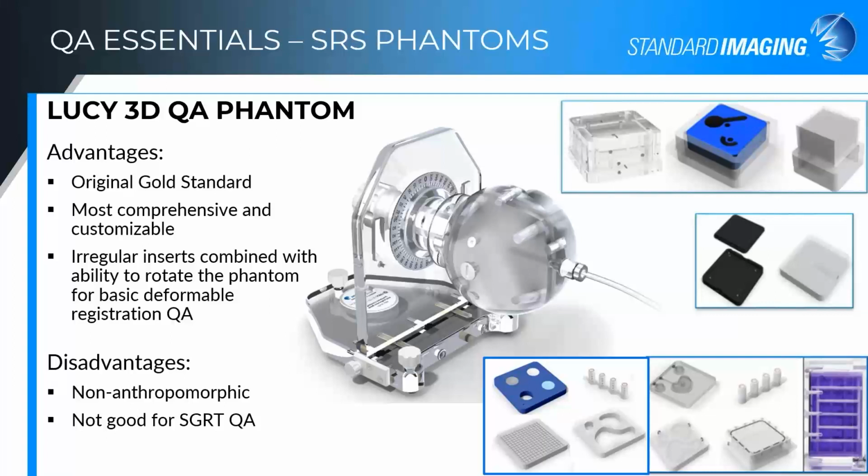So those things are really important and add to the features of Lucy. There's nothing more frustrating than trying to do those measurements and having things come out not where you want them to be and ultimately realizing it's because you didn't put the detector in all the way. Yeah, very frustrating.